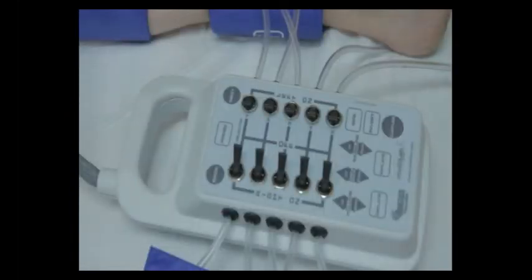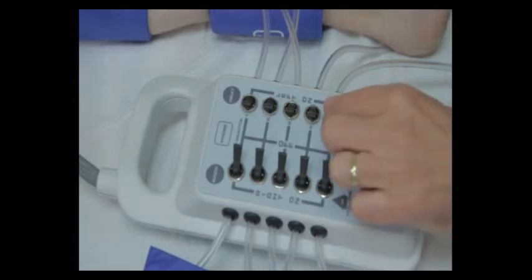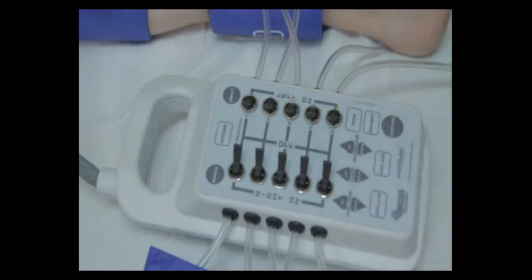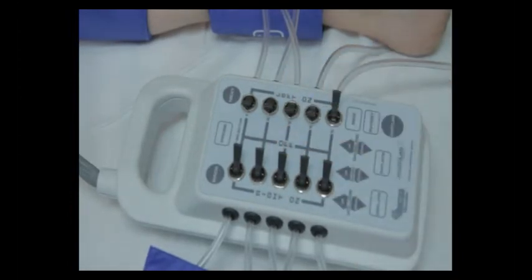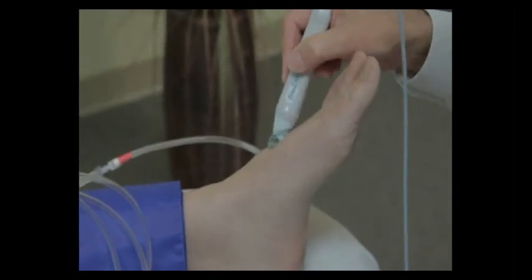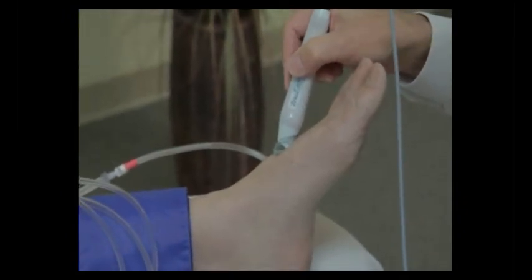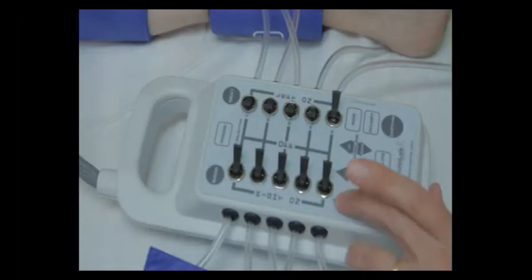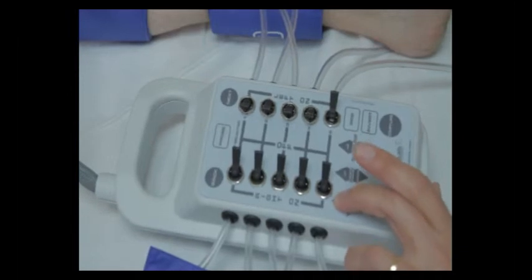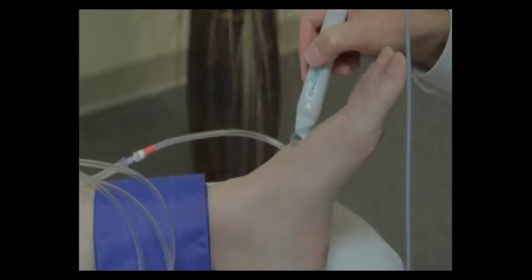When using your multiple cuff selector to obtain pressures, you will use one valve at a time. Right now I'm going to be taking a pressure at the left dorsalis pedis artery, so I'm simply going to open the left number five valve, volume up a little bit, and inflate the cuff.